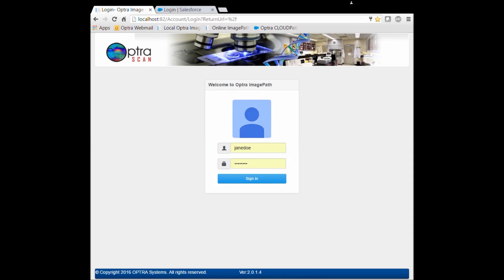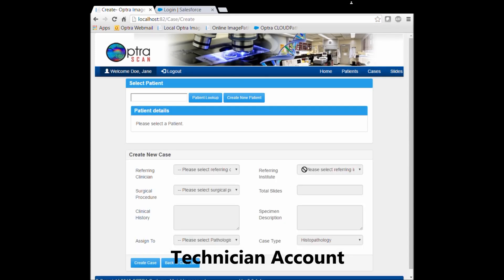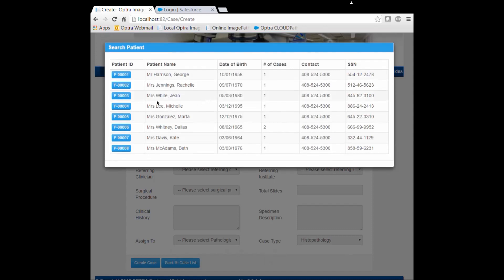ImagePath is our web-based image management system, which gives pathologists a holistic view of patient and experimental cases. We've designed this system to simulate conventional pathology laboratory workflow, wherein a technician can easily access scanned tissue images and assemble them into cases for pathologists to review.